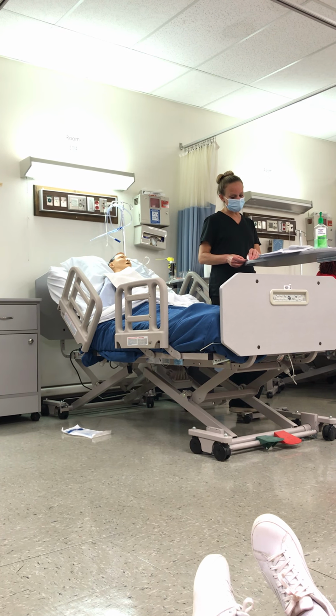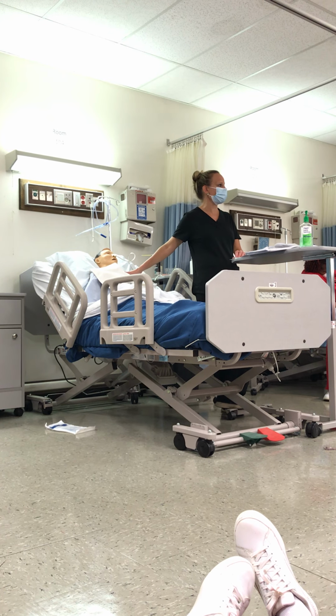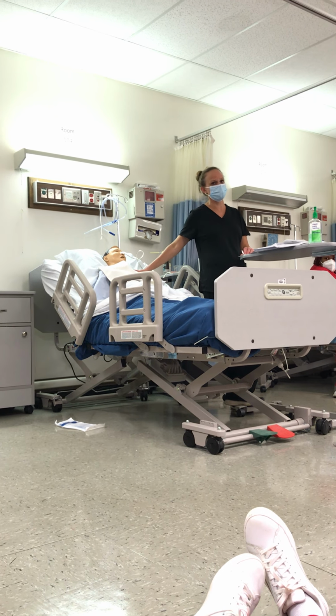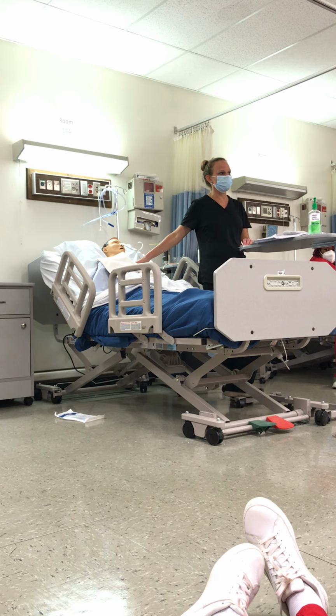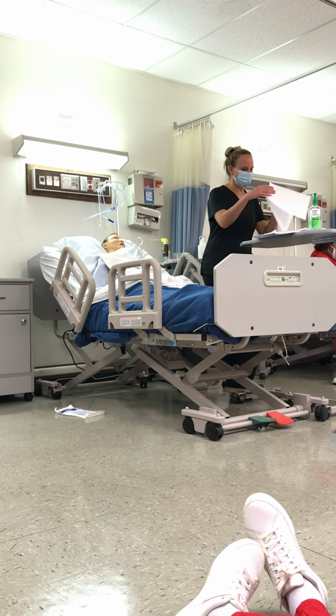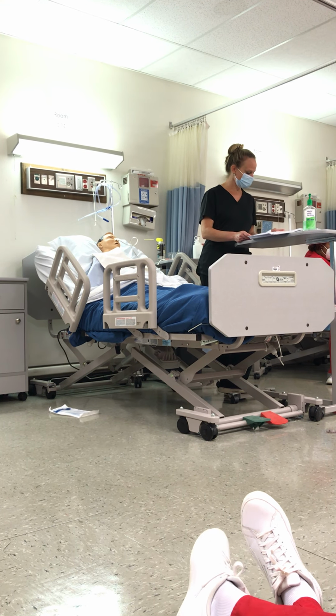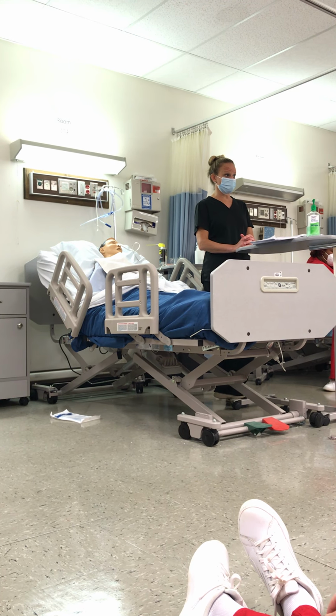And then position the bed elevated at 30 degrees. Do they have to have their bed at 30 degrees or 45 or supine if they just got an NG tube sitting in there? Doesn't really matter, right? Because nothing's going in right now, okay? Any questions so far? I think we need a break before we start the next one.